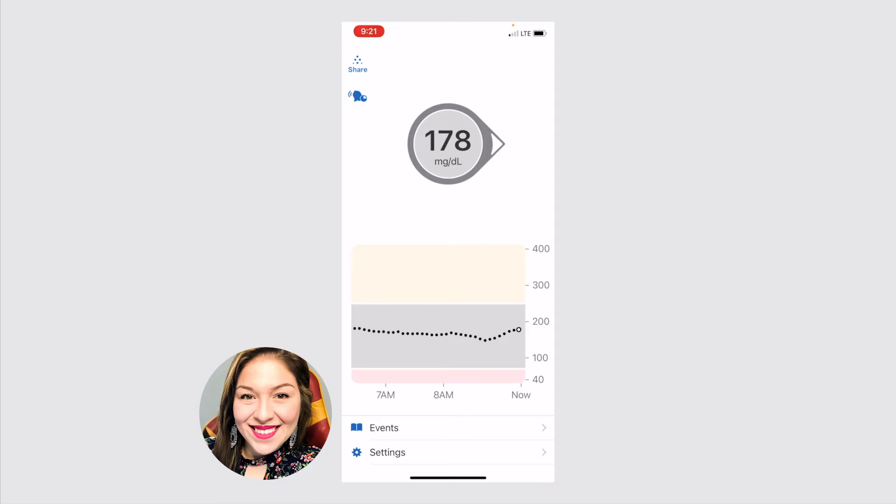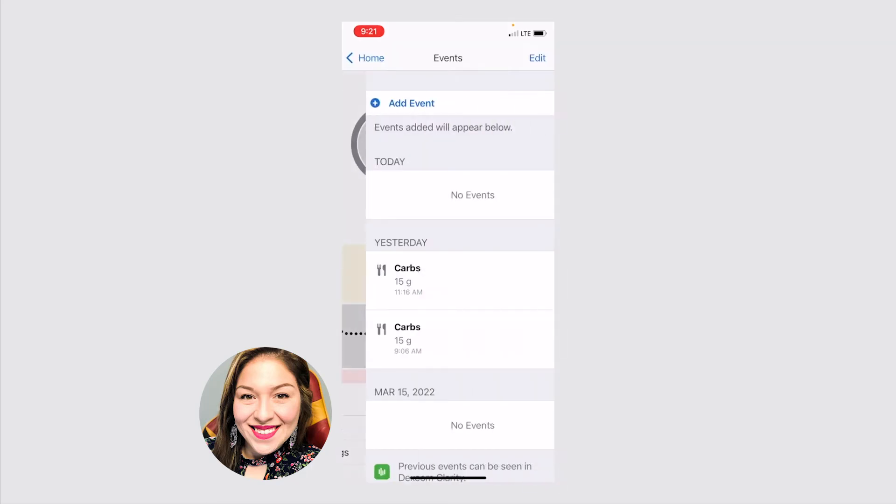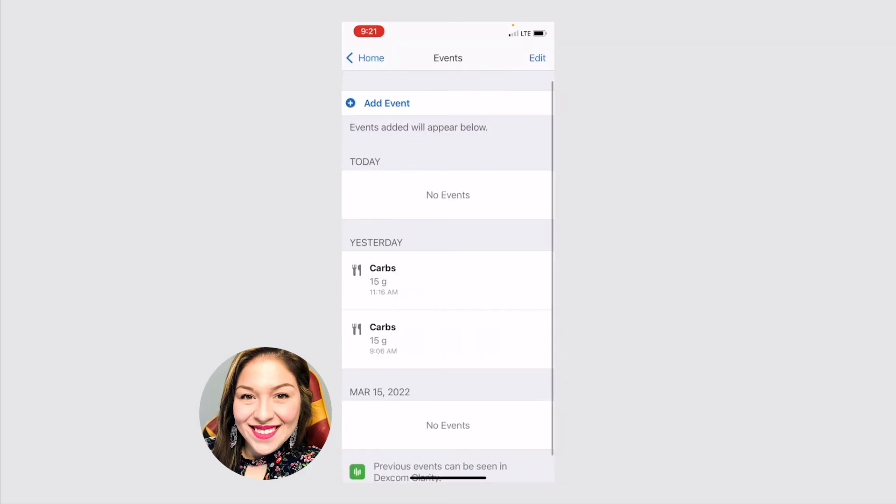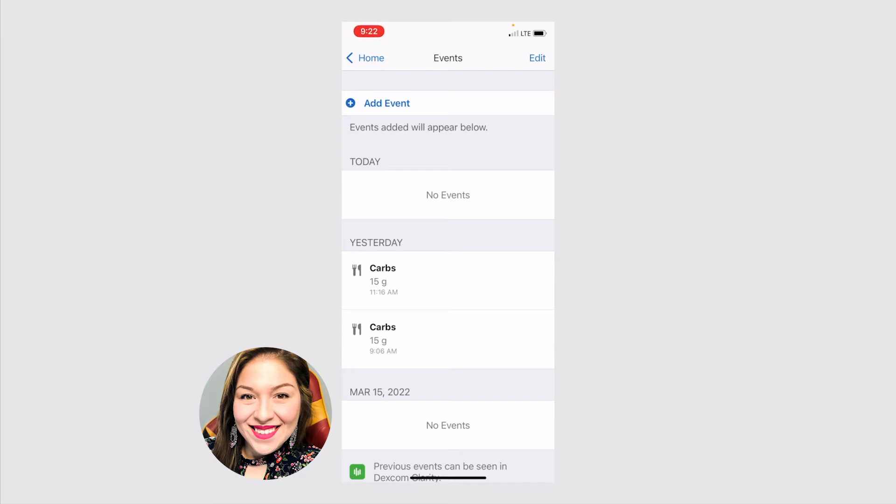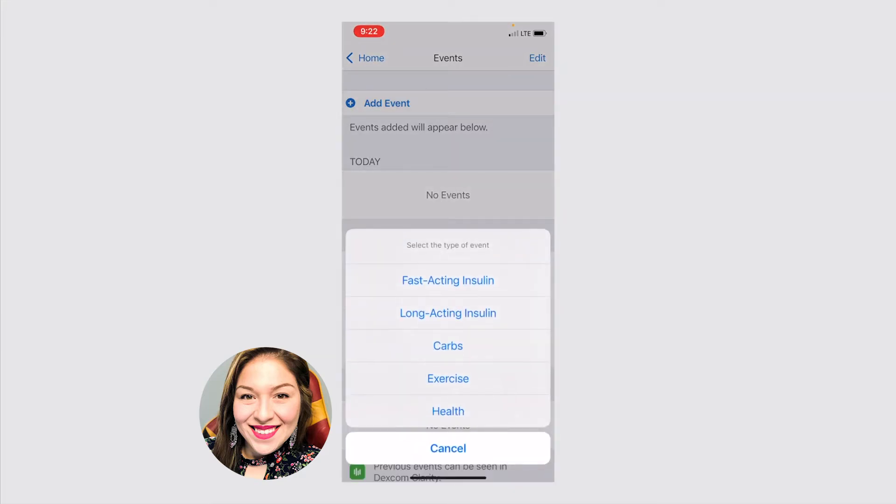We'll start with the events here at the bottom. This is a really great way to log information that's important to talk to your doctor about during your appointments. This is a way that you can take notes and then share them and have access to them during your appointment. So we'll go ahead and click add event. There are a few different options here. This is a great way to log your insulin, to count your carbs, to track any exercise, and then any other health information that you want to include.